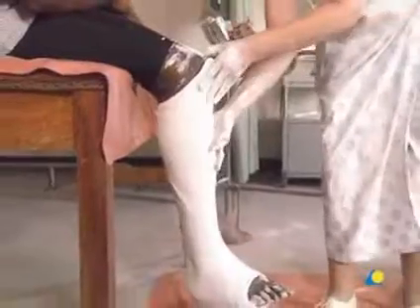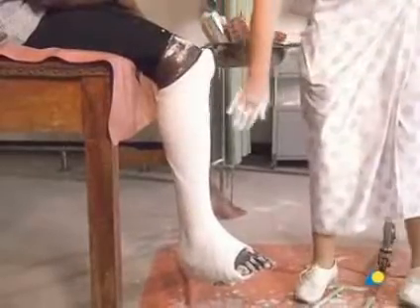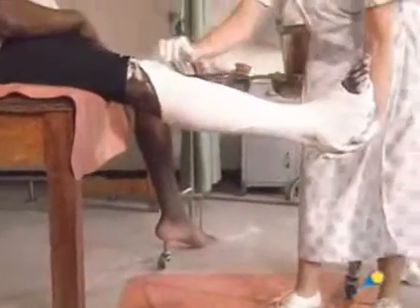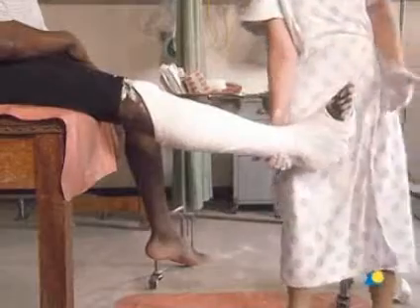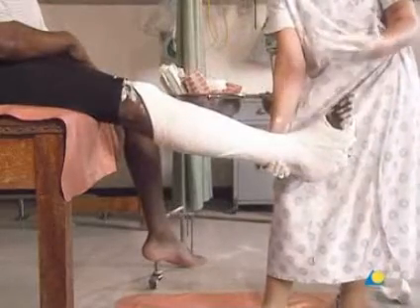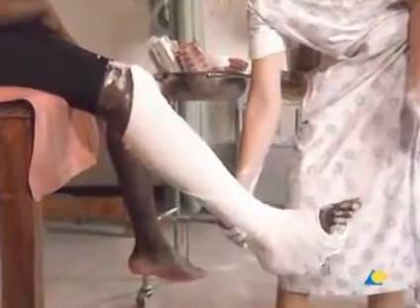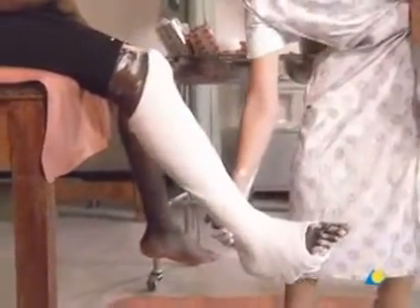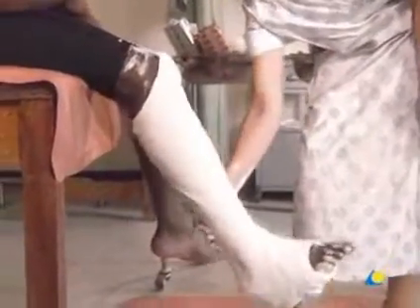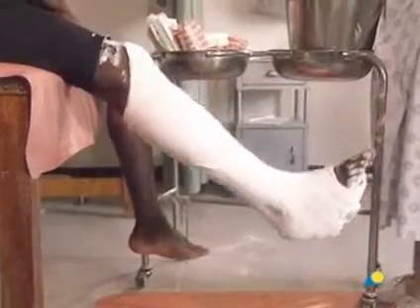As the PTB functions as a weight-bearing cast, the patient should be instructed to wait 36 hours before beginning to walk to allow the plaster to set. The exercise for the patient can now be explained and demonstrated: the patient sits with the leg extended, lowers the leg to the point of soreness, holds it there for five seconds, and then extends the leg. The exercise should be repeated as necessary to relieve any soreness of the knee.